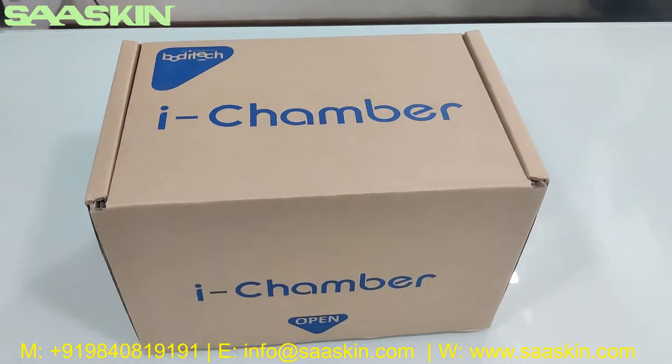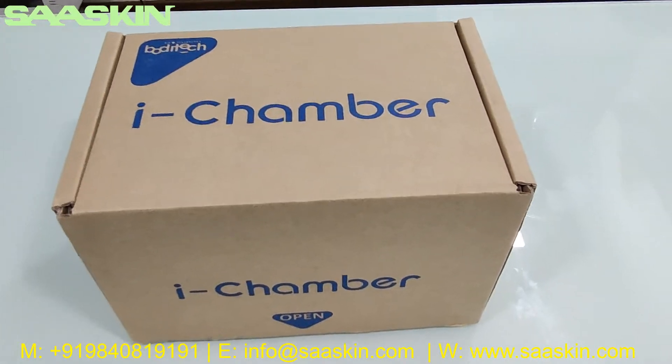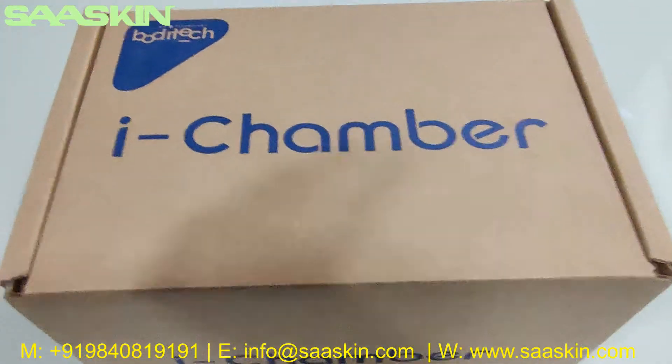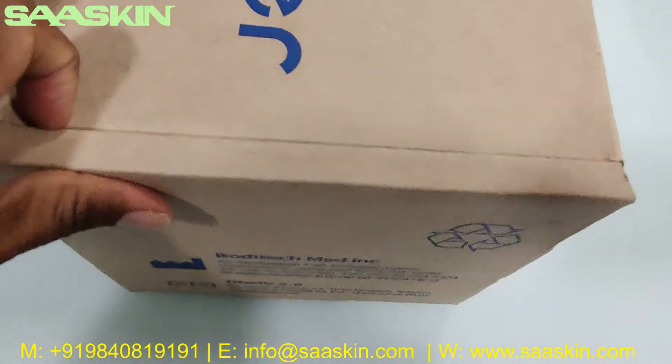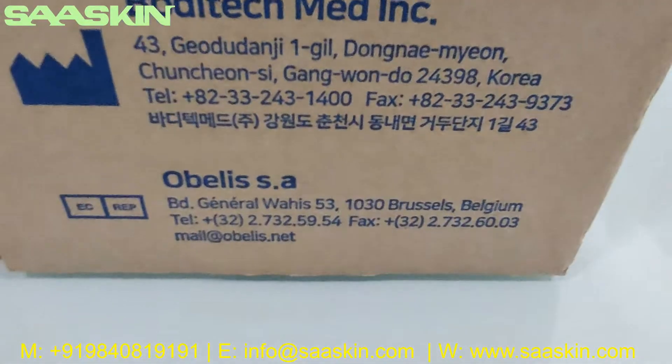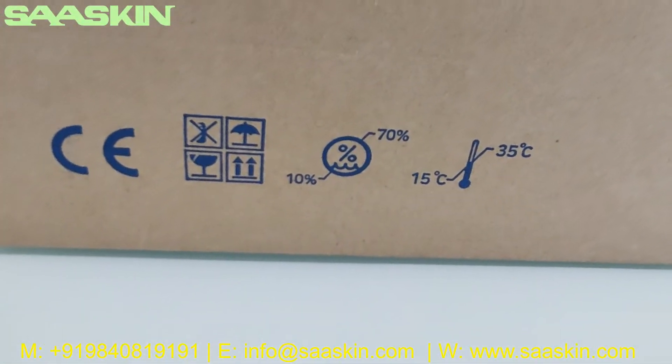Hello everybody, today we're going to see the unboxing of Bodhi Tech i-Chamber. This is how the box looks when you order i-Chamber from Bodhi Tech — it's from Korea. This is how the box looks like, and it's a CE certified product.